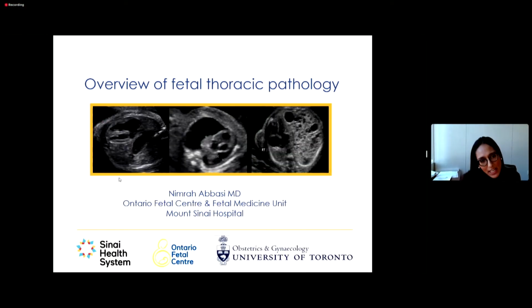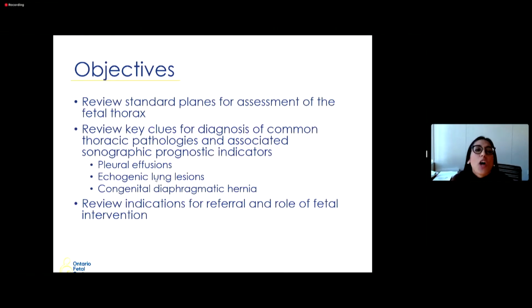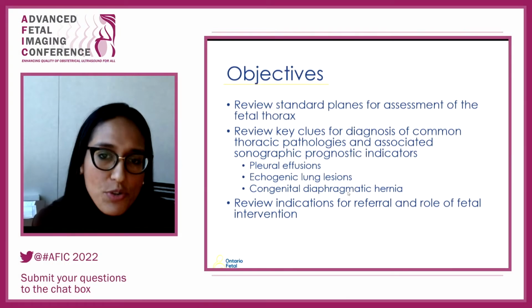The second half of this presentation is going to be on the overview of fetal thoracic pathology. So we're completely changing gears. And again, I have no disclosures. The purpose of this talk is really to review the standard planes for assessment of the fetal thorax, so really focusing on what views we need to get.